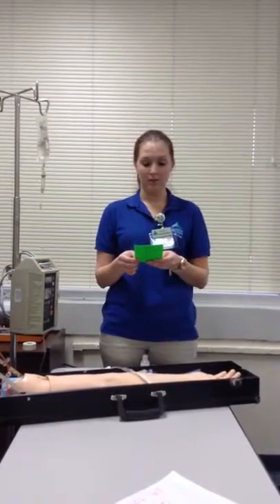Doing a piggyback med administration. I have a doctor's order here for some Flagyl. Some adverse reactions are seizures. Some symptoms are dizziness, headache, nausea, and abdominal pain. Action would be for a bactericidal drug that disrupts bacterial DNA and protein synthesis.